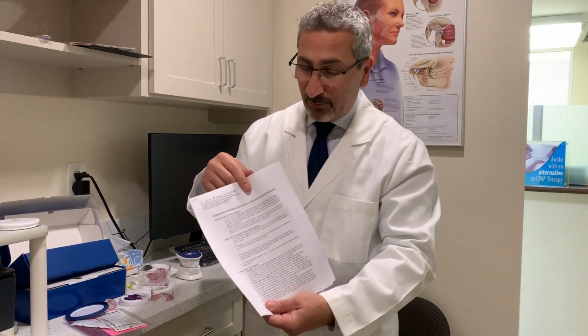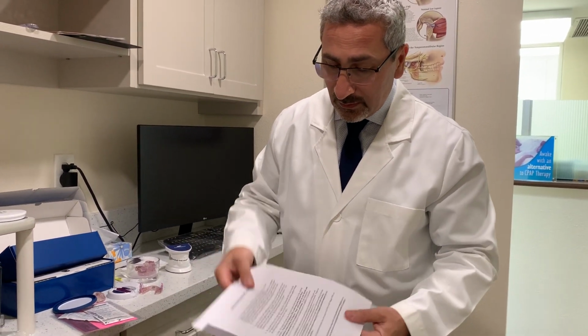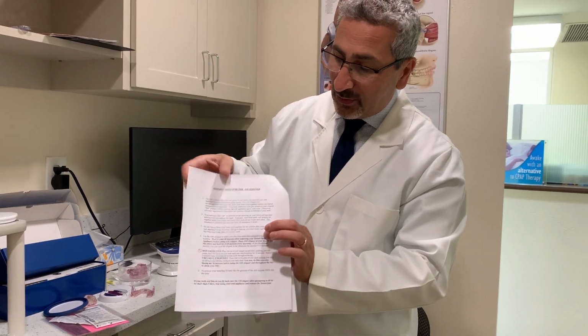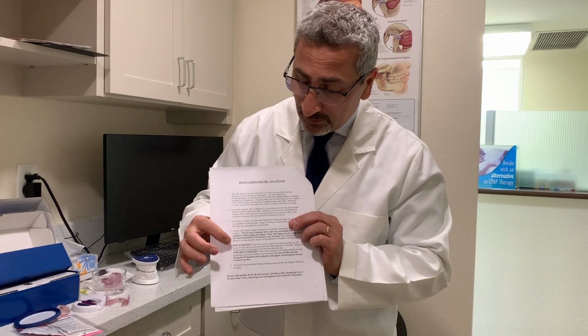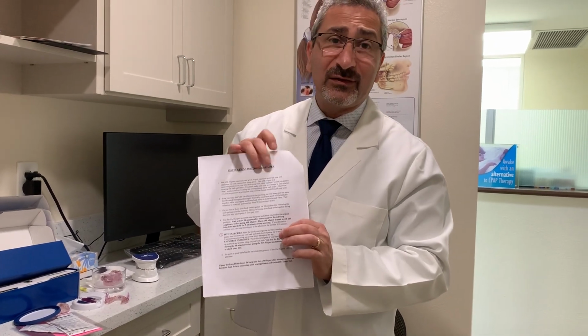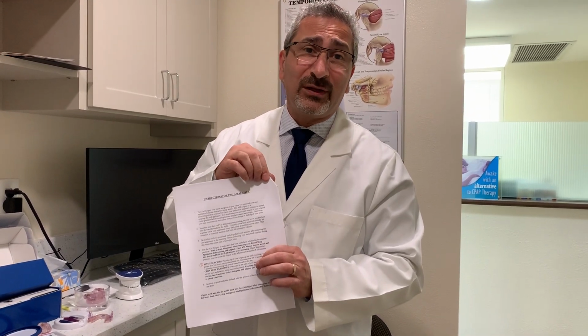Other than this positioner, and you can use this for several minutes, I am giving you some bite exercises. So if you go to the instructions, go to the second page. Number 4 is the AM aligner, which I am not making for you, so I'm giving you that bite piece. But number 5 goes over 2 bite exercises. These you can do in the morning and anytime throughout the day to get your bite to resettle into place.